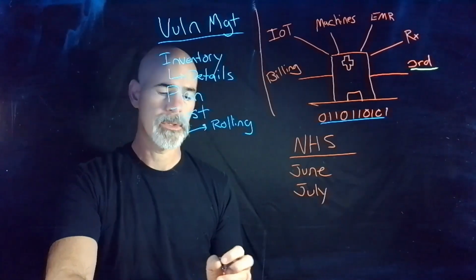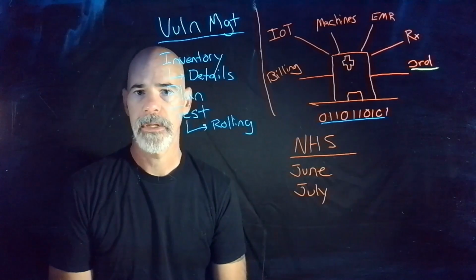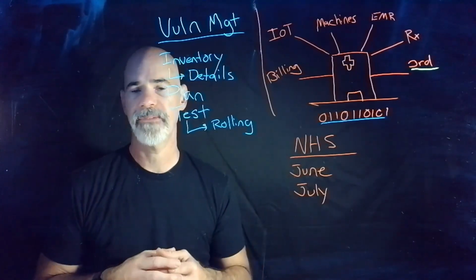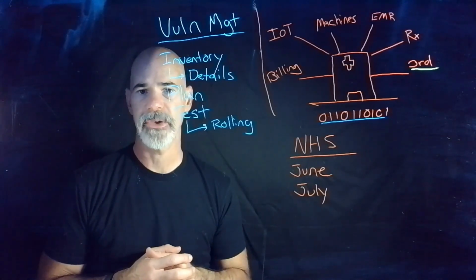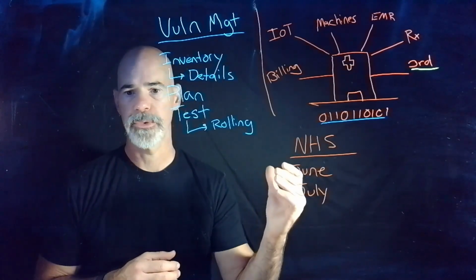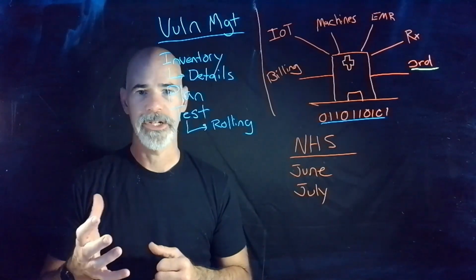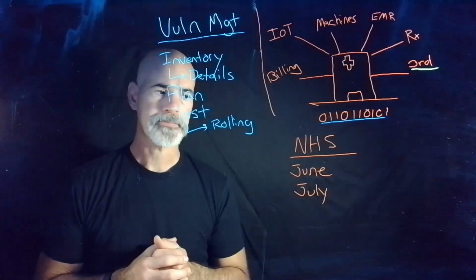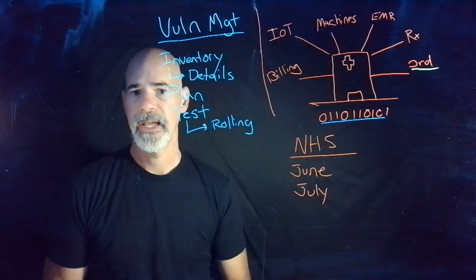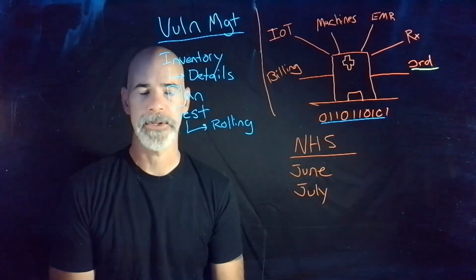So I leave you with that, because patching is a very difficult thing to do correctly, and it does require having that inventory of all the assets that you have. What is the criticality of those assets? In order to be able to push patches to those assets, you need to know which ones are internet connected, which ones are at higher risk, and then have a plan for the downtime. Be able to patch those systems, test, and ensure that they are up to production quality.